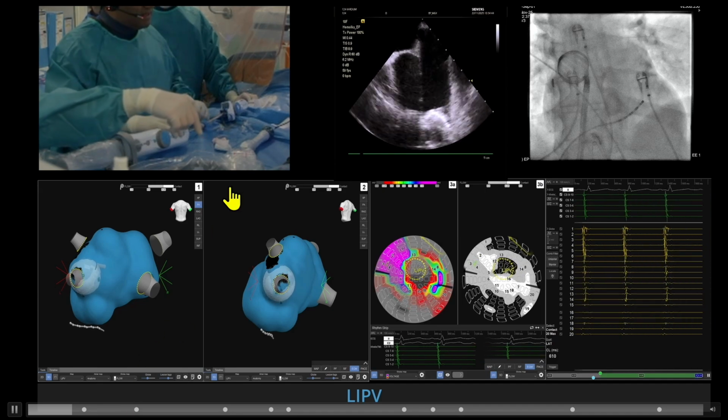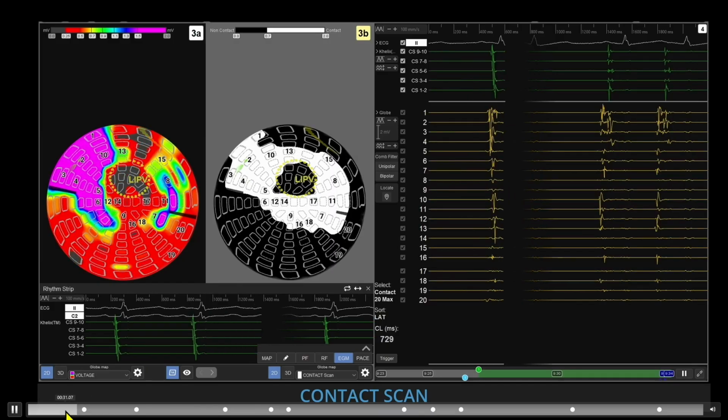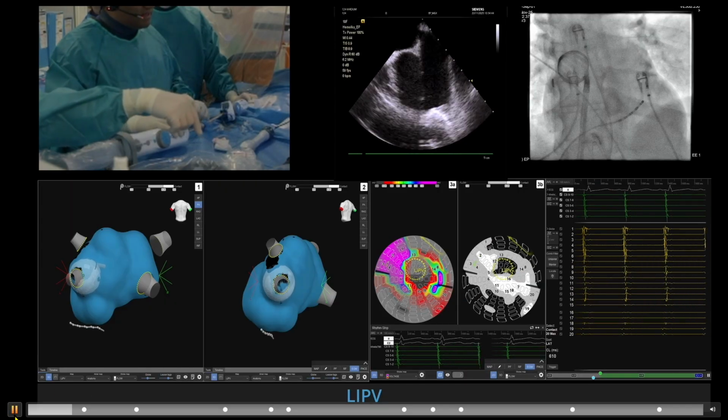So here we're going to manipulate the device. Actually, let me just go back one step here. Let me pause here for 1 second. If you look at here, the sheath is here. This is the actual device here. In this case, we have a coronary sinus catheter also. As you sweep it around within the chamber, you can create an electro-anatomical map.